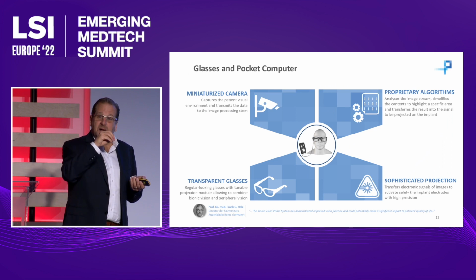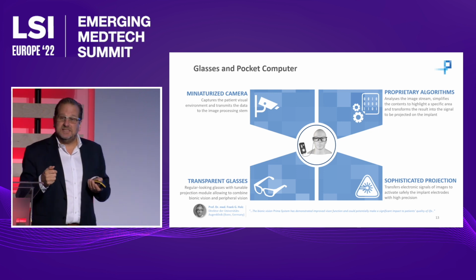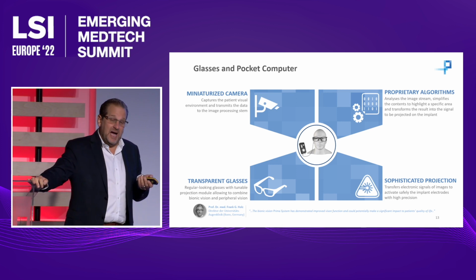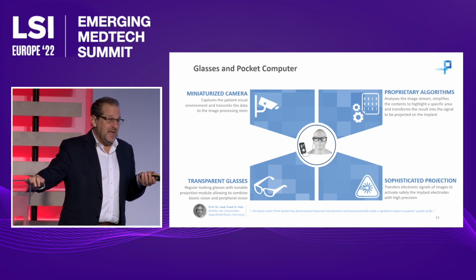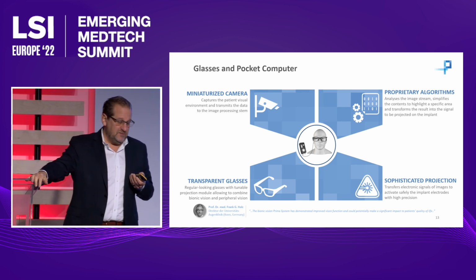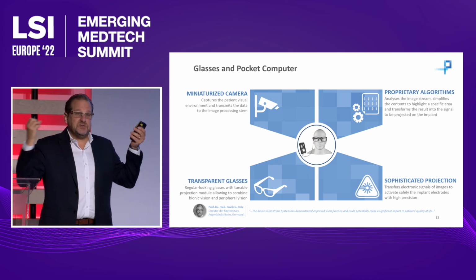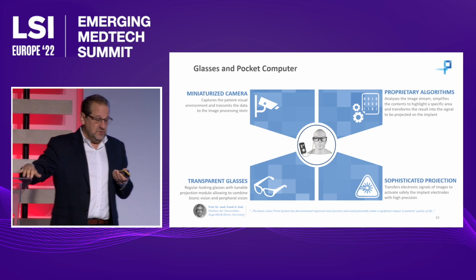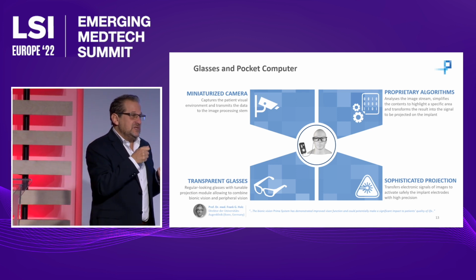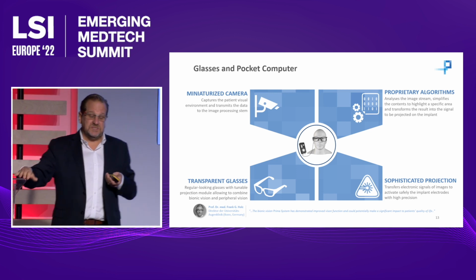So the implant is then surgically implanted, and then 4 weeks later, the patient comes back after the retina is healed, and we then put these wearables on them, these glasses, with a pocket computer that actually communicate with the implant. So what happens is, patient comes back, we put the glasses on, we have a camera that we mount in front of the pupil where the implant was placed, switch the system on, the camera captures the environment, sends that image to the pocket computer, which processes and simplifies the image, and then sends back that image in the form of infrared light through the pupil to the implant, where it'll stimulate the individual cells on the implant.